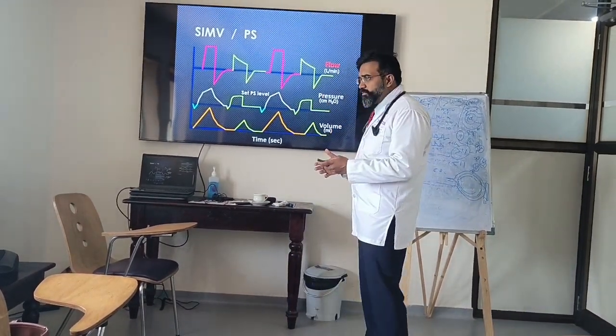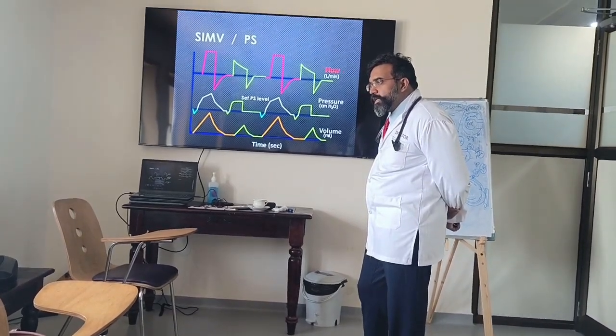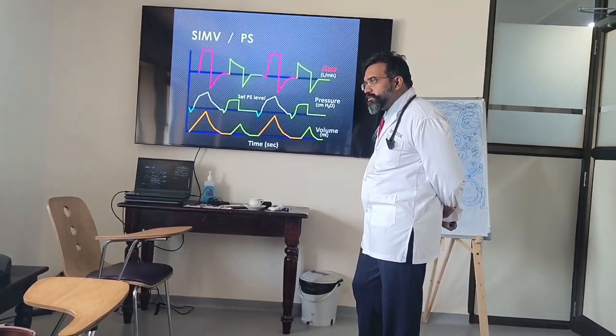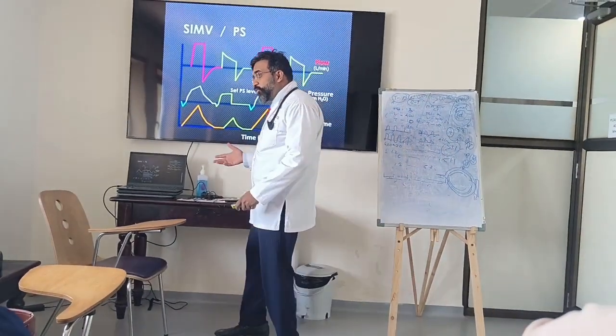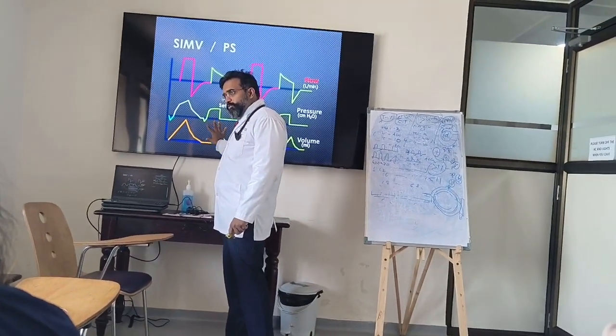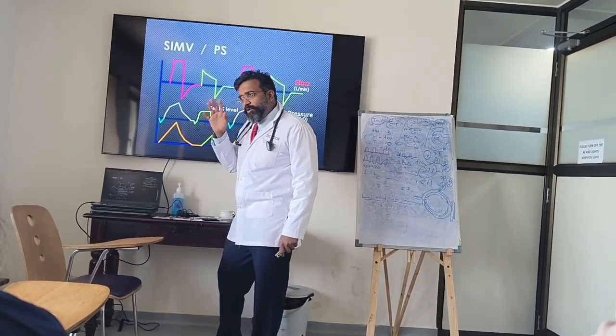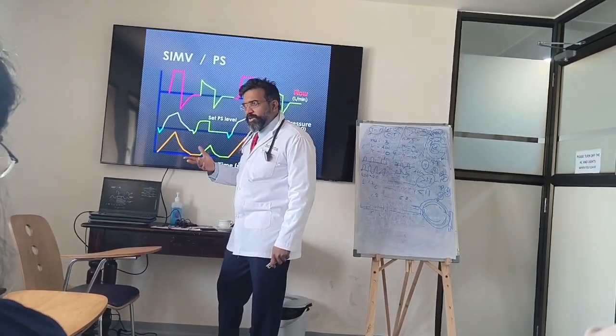Pressure support? So sir, here we're not setting the time, right? We're setting the flow. I'm only setting the flow, we're not setting the time for this. I'm setting the time. Why is this now dual? This is a dual mode, no? Here it is SIMV, volume control with pressure support. What have I done? I have set the time for volume control. You understand? That's what's called SIMV pressure support.